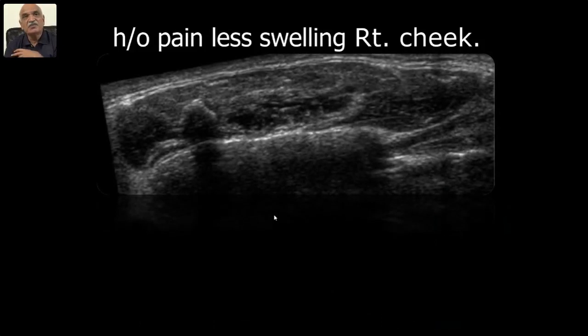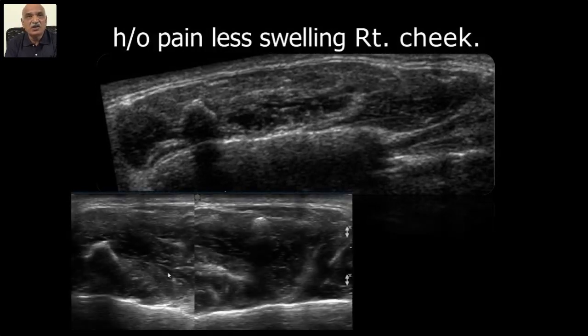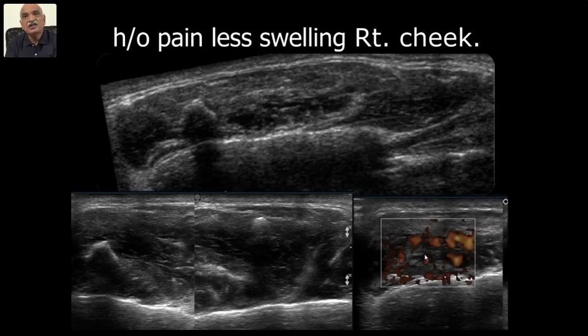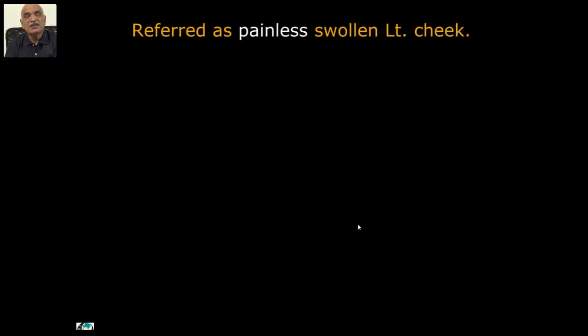So the patient has symptoms, we found the cause — post-traumatic hematoma. Another case of painless swelling right cheek: you can see a dense lesion with acoustic shadowing — it was nothing but a masseter calcification, about 9 millimeters, beautifully and easily diagnosed.